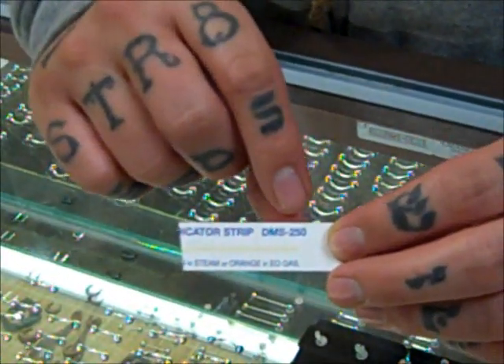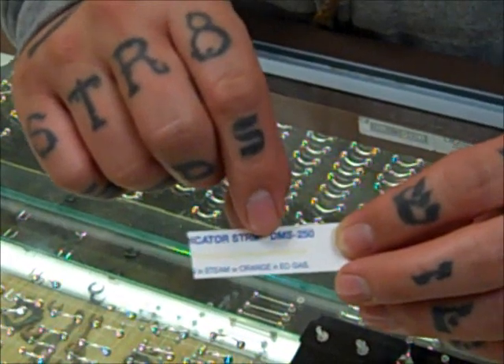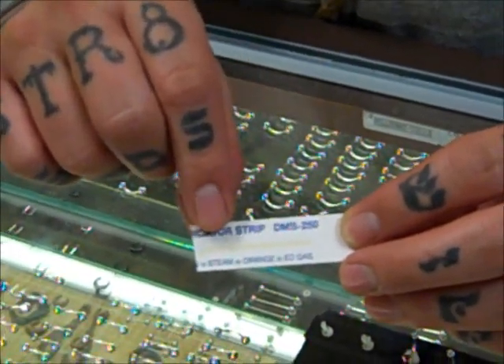When you come into the studio, I may offer you an indicator strip that looks like this. This is a heat-sensitive strip that has a yellow line on it, and when it becomes hot enough to be sterilized, it will go from yellow to brown. I'll have you put your name on the backside of this, then I'll run it through the sterilizer with all the tools and jewelry we'll use for your new piercing today.